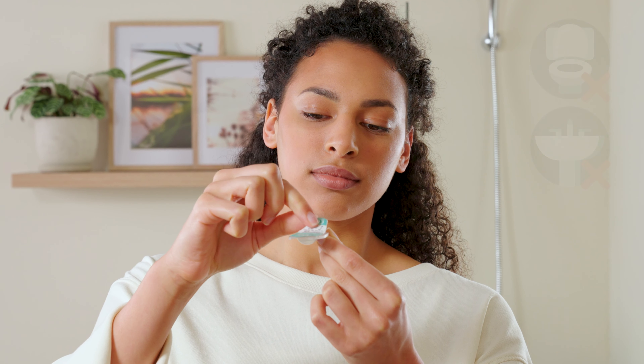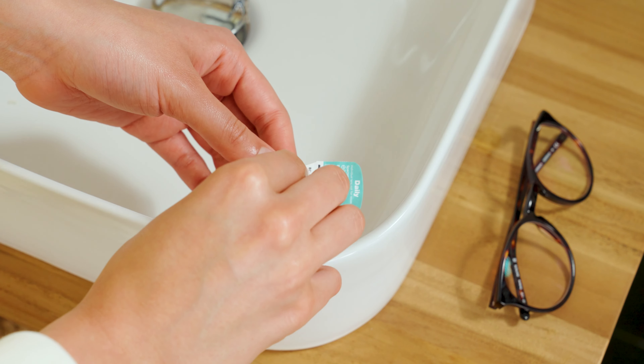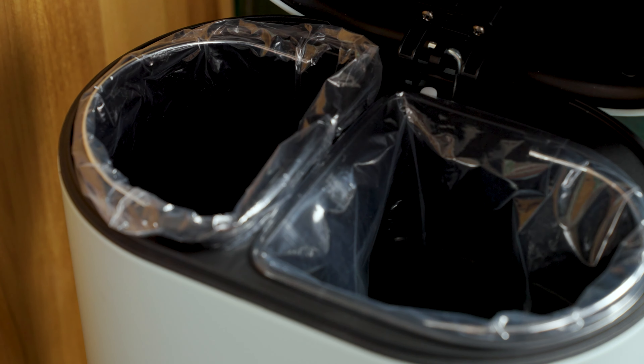Remember, never dispose of your lenses down the sink or anywhere that could harm the environment. After you've opened the case, tear the foil away from the plastic casing and recycle it where possible in line with your local guidelines.